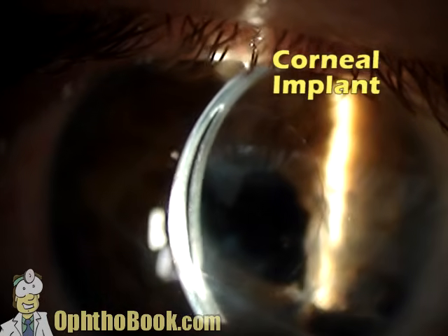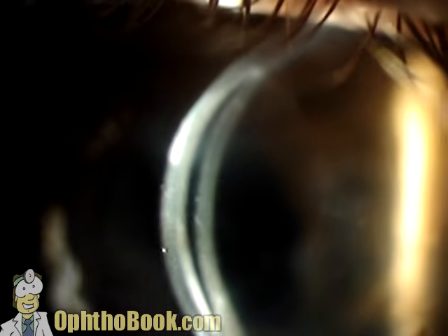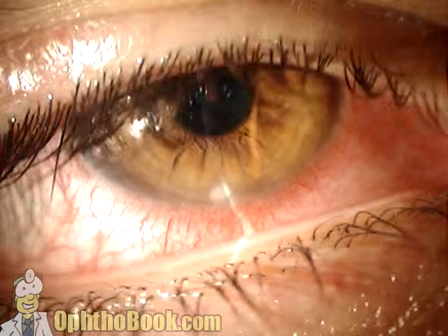This is an experimental lens done about 15 years ago. It was put inside the cornea itself. And when we do our cross-section, you can see that dark gap right in the middle of the cornea. A very elegant way of looking at the cross-section. Very nice. This is something we see a little bit more often.